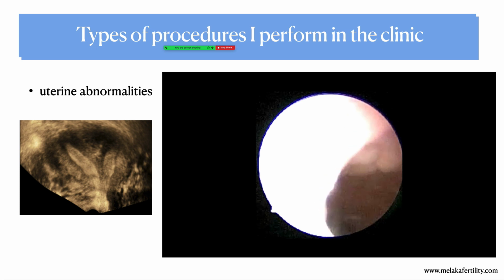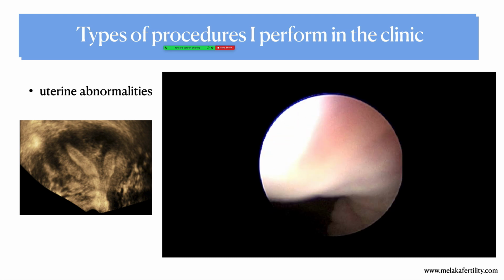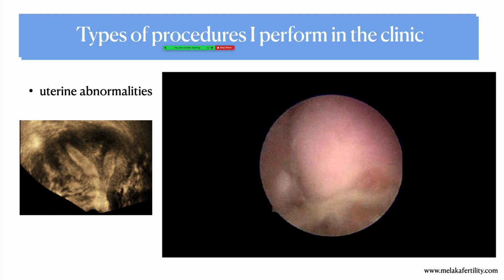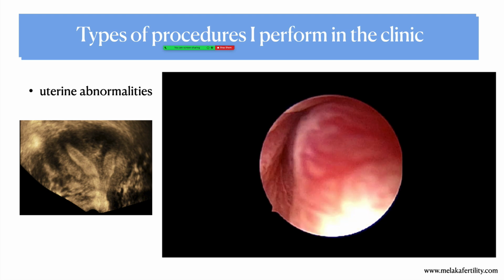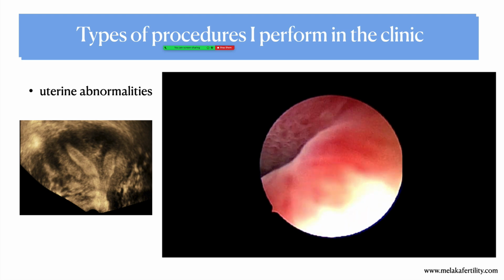And this is I'm out, and then I go into the other side of the septum. This is the whole septum actually, and this is the other side. I go into the other side and go into the other uterine cavity, and this is the other uterine cavity. So once it's in, and so this cavity is also normal.